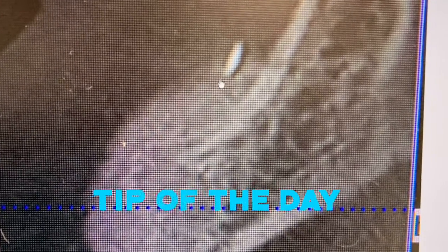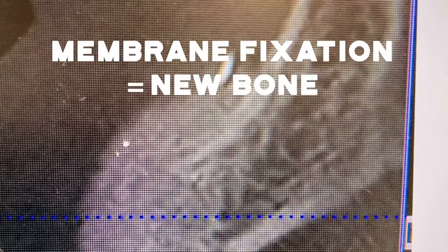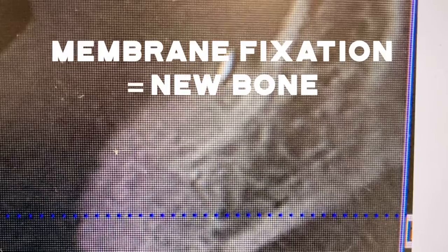And again, here's a further shot across, and you can actually see the original deficiency of where the tooth, or at least some of the tooth, was sitting there. This is a little tack, and this was the tip of the day: the membrane fixation is extremely important in these types of cases, and particularly when dealing with those narrower incisions, the tack fixation really helps with soft tissue adaptation around the site. And then there's another view there. You can see there's some vertical augmentation, in particular horizontal augmentation.